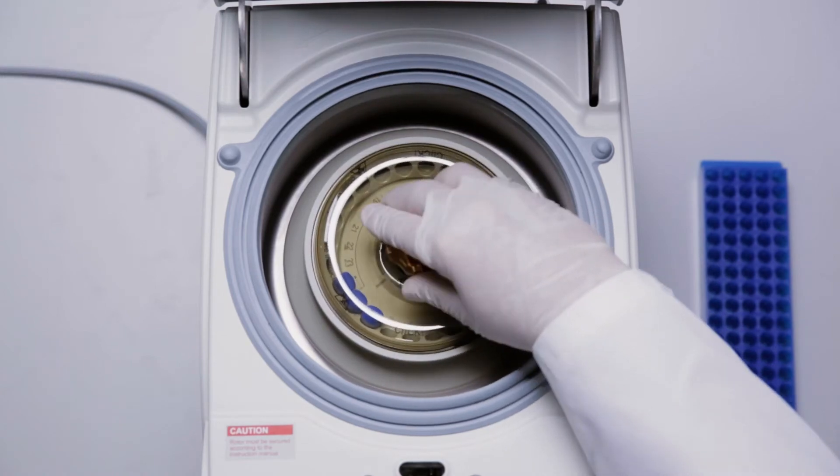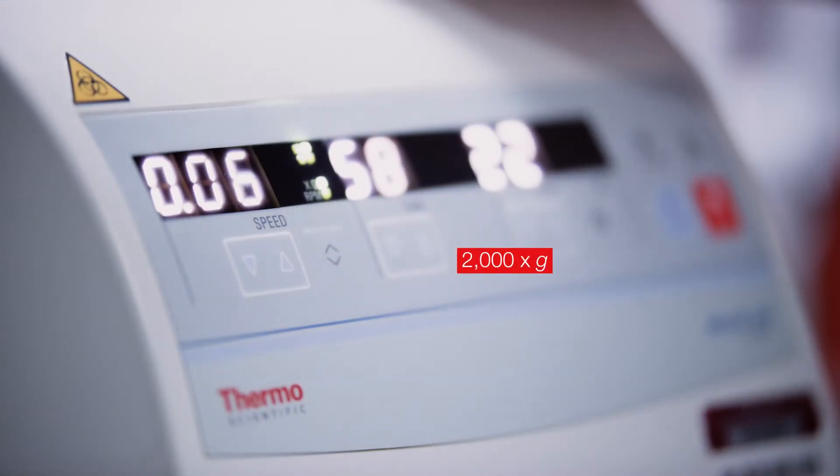To start, centrifuge each antigen standard vial at 2000 g for 10 seconds.